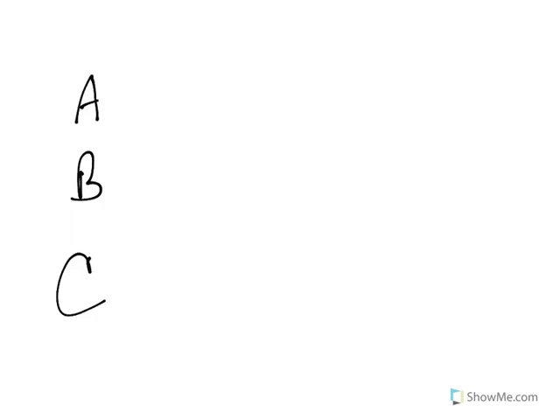Okay? And Sgarbossa A, what we see with our left bundle branch block, and again, this can be pretty much in any lead. You could look at any lead, and I'm going to draw it as if it were in V1. So there's your big S, and then we go up like so. If we have the QRS traveling in this direction and the T wave ST segment traveling in this direction, Dr. Sgarbossa told us that is what we expect.